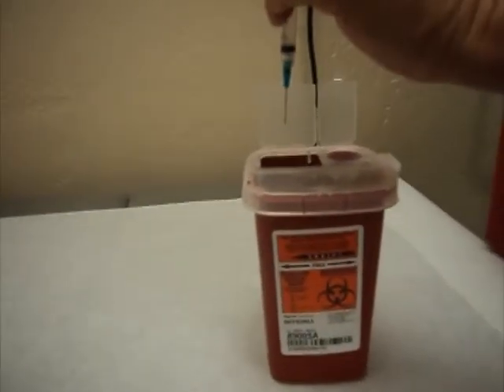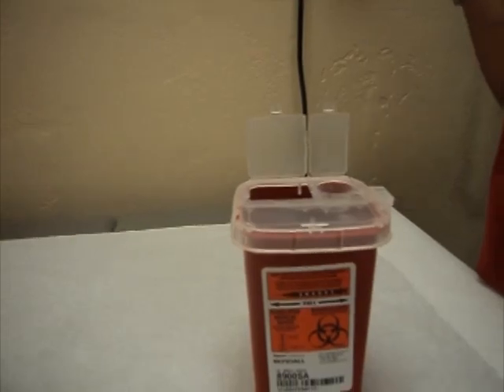The last step is disposing of the needle. It's best not to recap it. If you can, just stick it into a medical waste container.